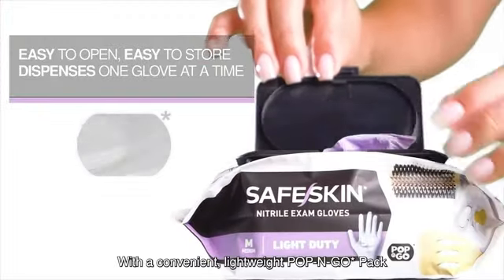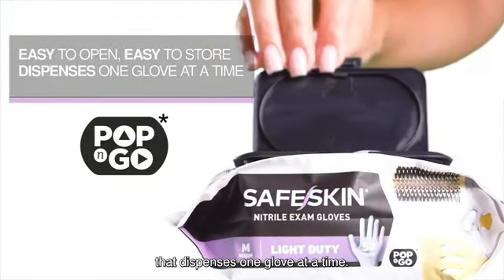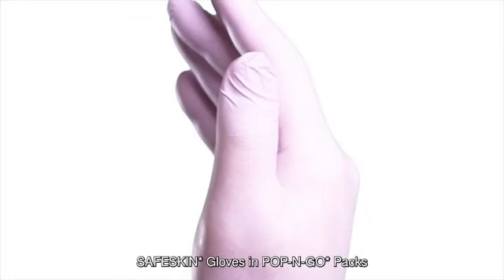Imported from China, these gloves adhere to strict quality standards and are designed to meet the needs of healthcare professionals.